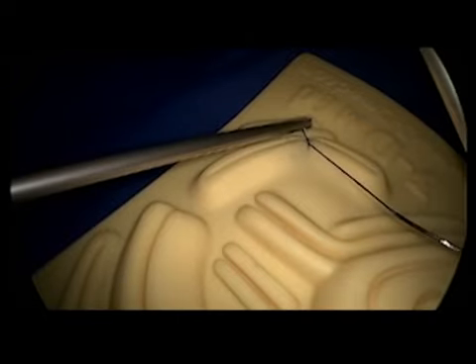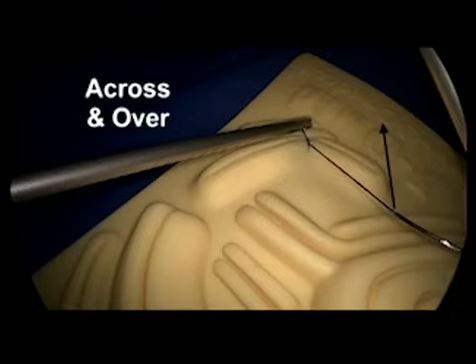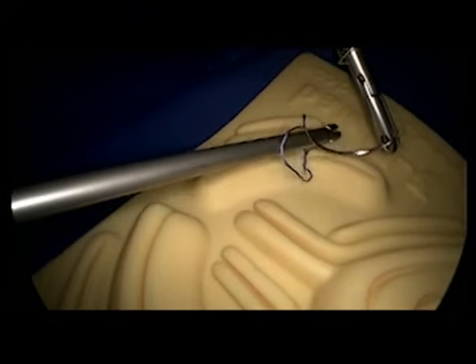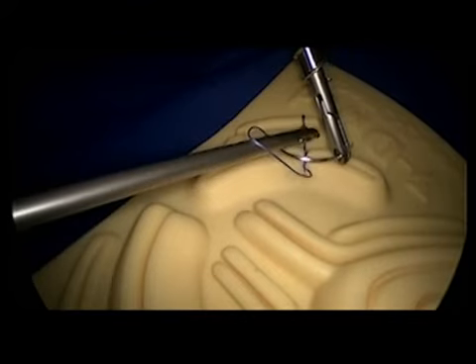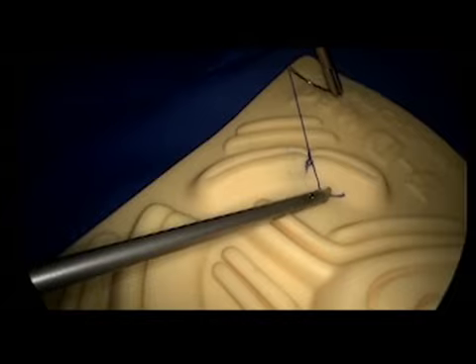the knot is secure. The knot preparation phase begins again, and the second loop is formed, moving the assisting grasper across and over the suture line. A counterclockwise throw is made, and the short tail is grasped, the loop moved away, and the tail moved over the suture line to secure the knot.